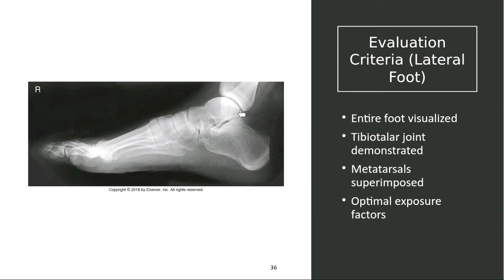The metatarsals should ideally be superimposed to know that your plantar surface was in a true perpendicular plane to the IR. You can see this looks pretty good, and for the most part, those are pretty well superimposed. And as far as exposure factor, that is a really good lateral foot.